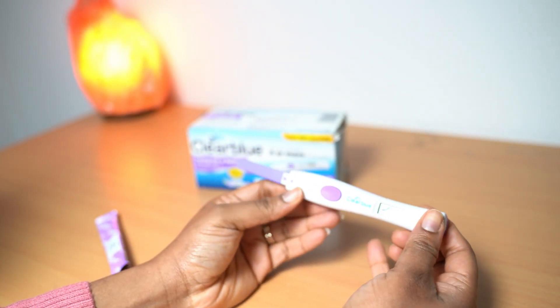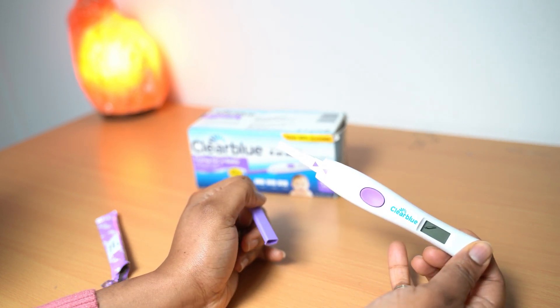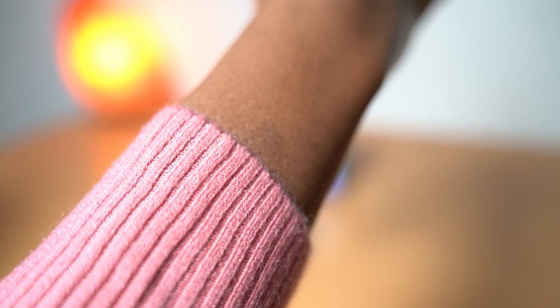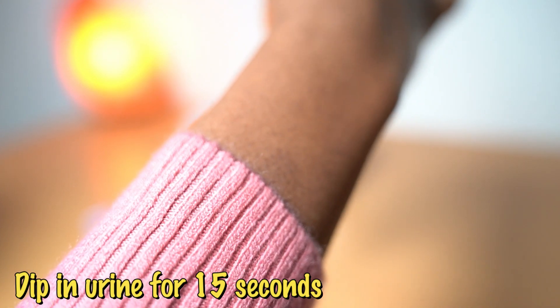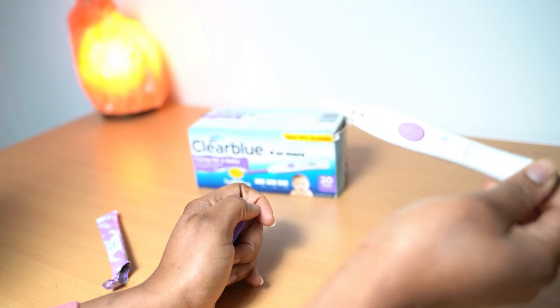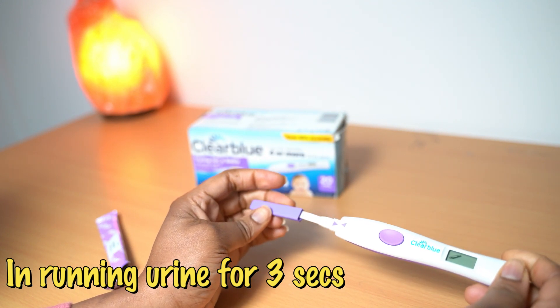So what you need to do now is open up this part, do a urine, and dip it inside of the urine for a number of seconds, or you run it under a tap for a number of seconds, then you close it like this.